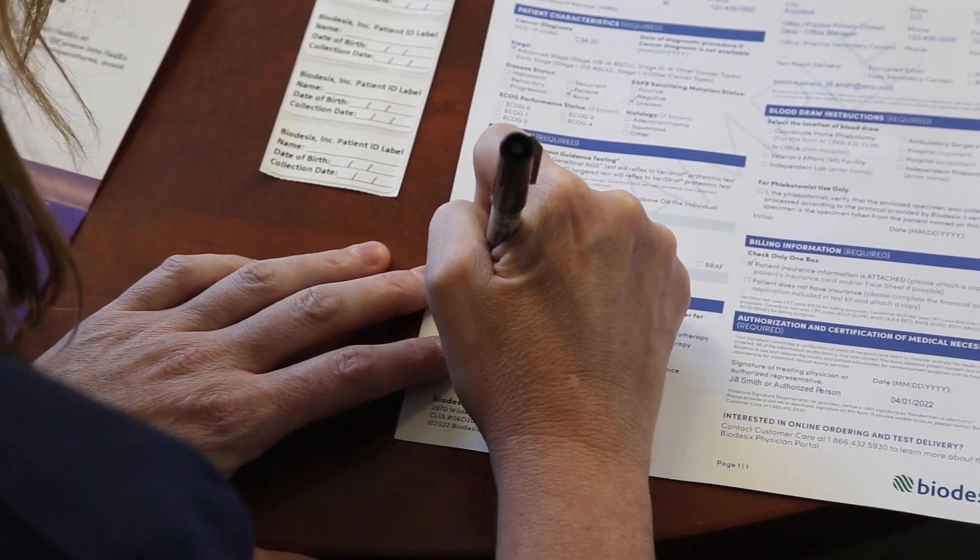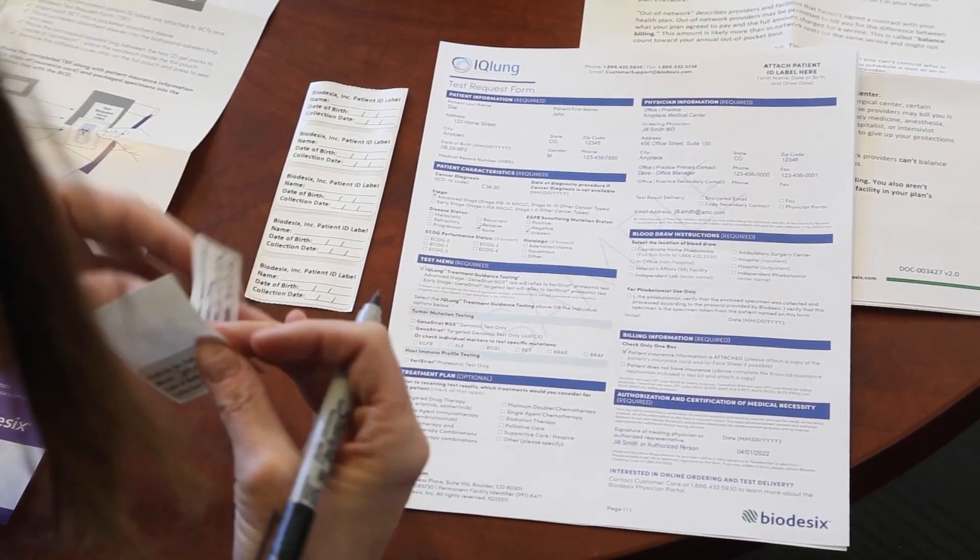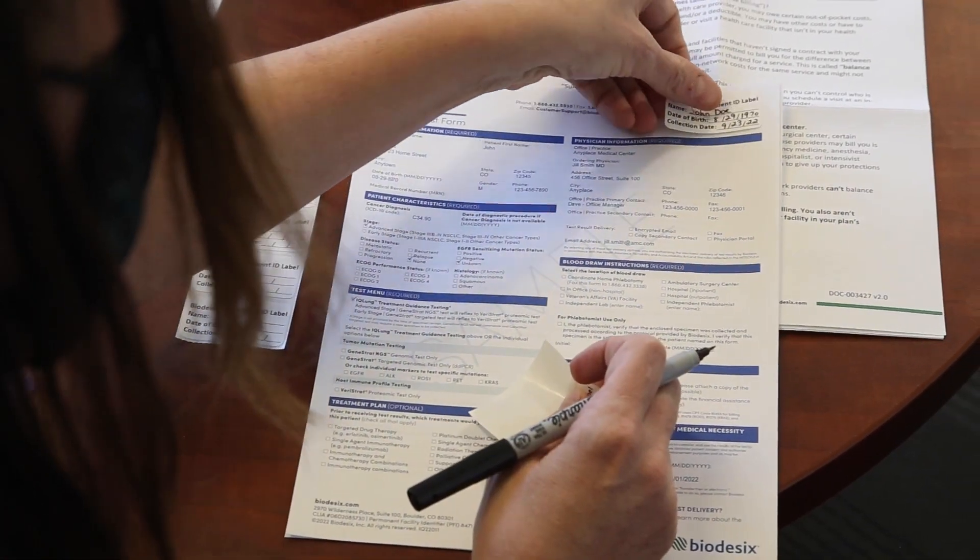Complete the six patient ID labels using the labels provided. Affix one of the labels to the completed test request form.